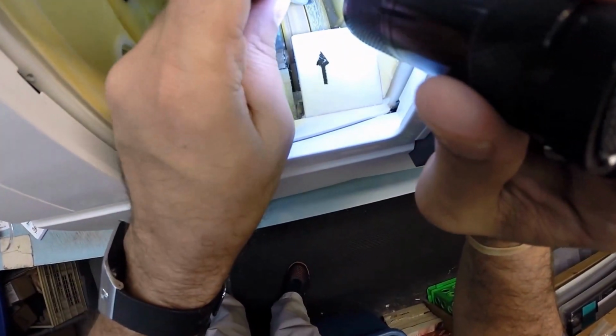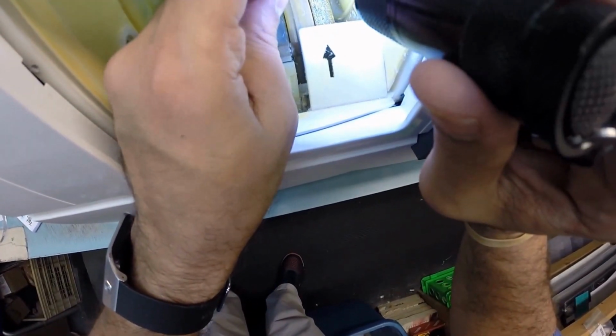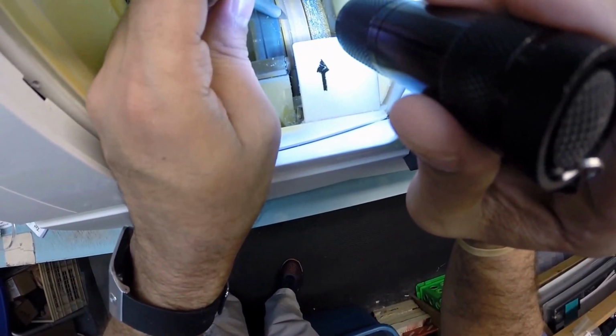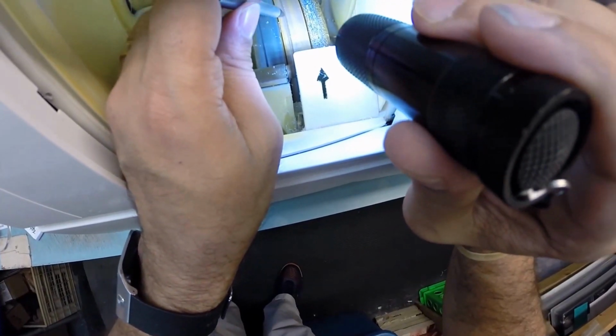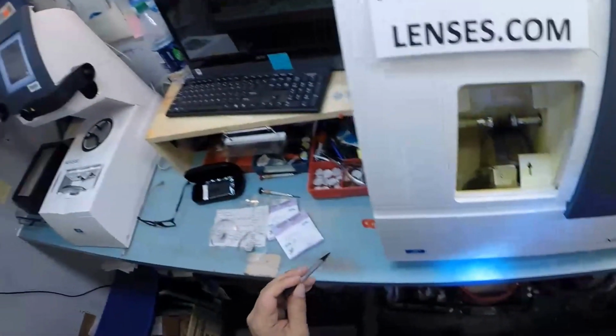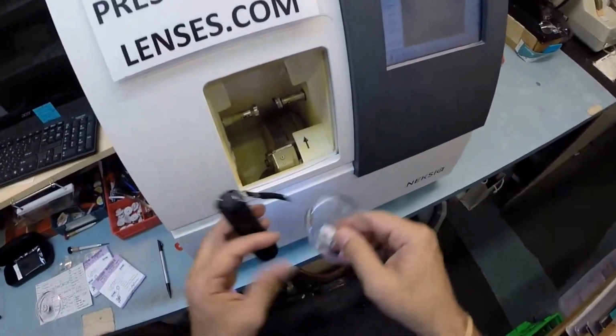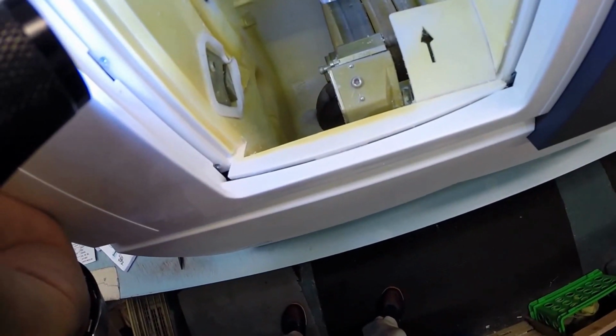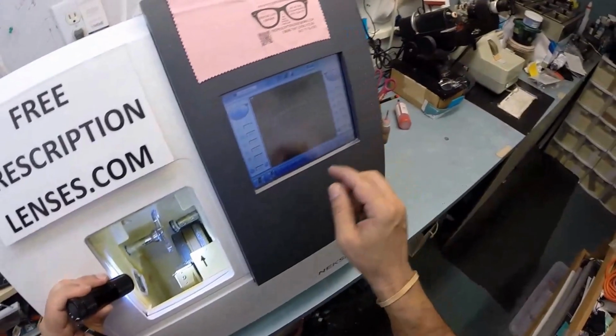But the actual cutting wheel is over here on the far right hand side of the machine. It's going to act like a heavy grit sandpaper to grind away your lens material until it's the final size. This wheel in the center with that channel, that little valley, that's what's going to put the bevel on the lens so it stays inside the bevel of the frame. Now the magnet is going to do its job a second time. It's going to hold it in place in the chuck, or as I like to call it, the Charles, because I don't know the machine well enough to call it chuck.